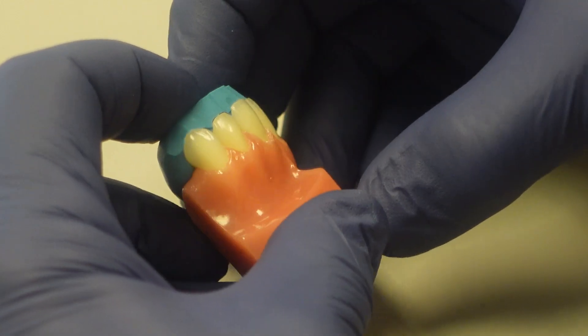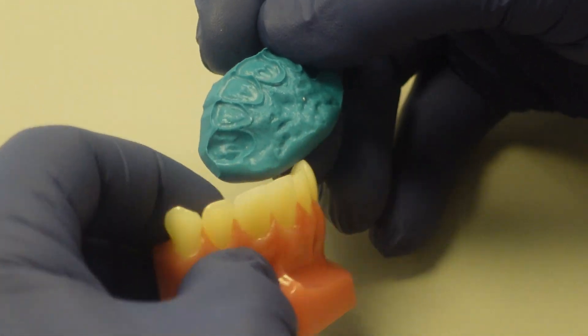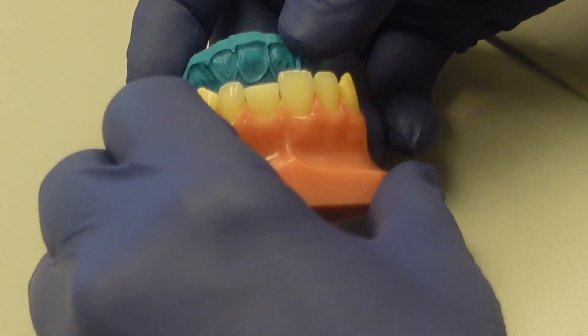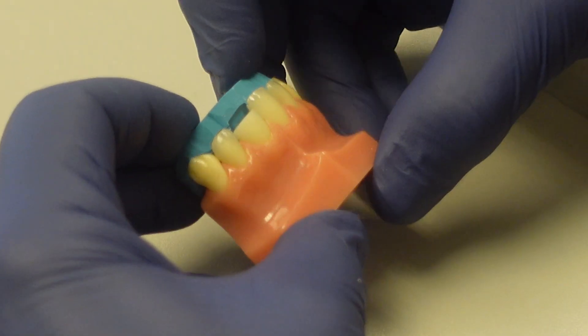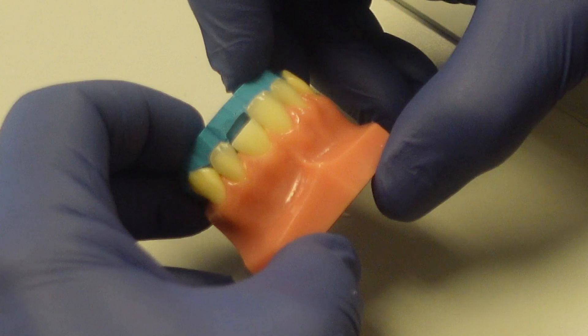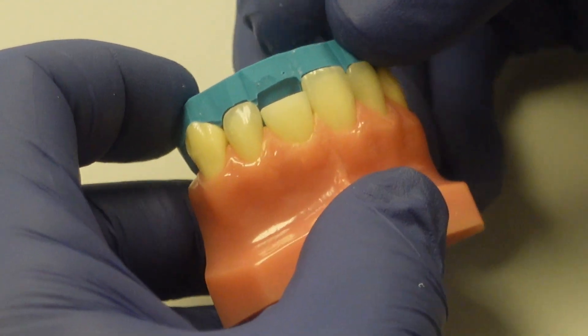Some people call it the palatal shelf — the first layer of the composite bonding. So once the template is created, I'm going to make sure that it's trimmed so that the facial incisal line angle is right where the trimming happens.